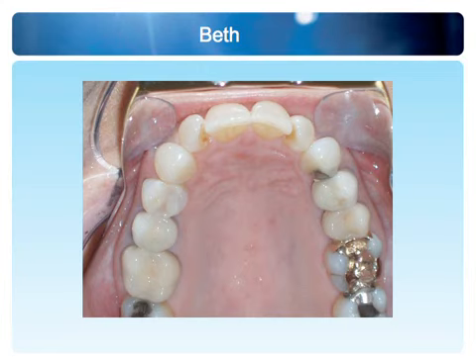And if I want to get the upper laterals in proper position, I have to move 14 teeth to get them in. And if I'm going to address or treat causes of that crowding, I'm going to look at the improper arch form here. This is more of a V or a box with a V combined, because that arch comes straight up, straight across and straight back. A V-shaped, box-shaped combination, it is certainly not a perfect Roman arch that we would like to see right around.